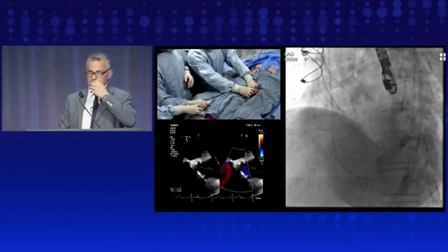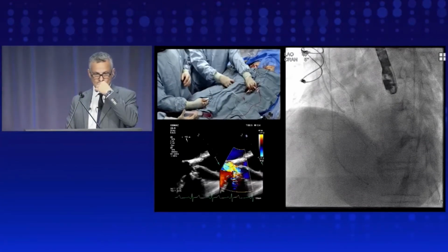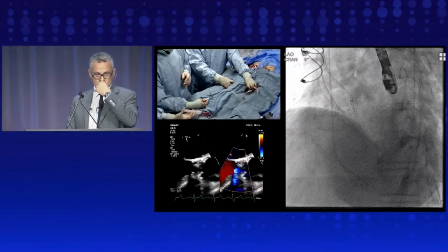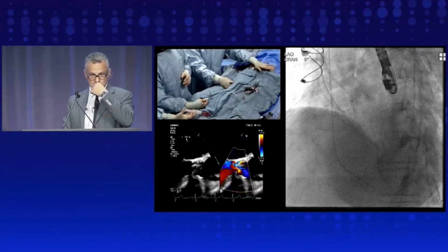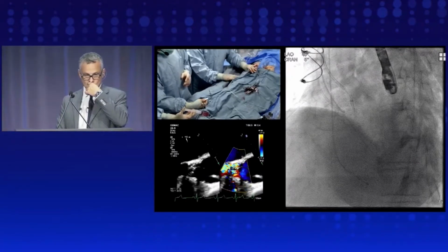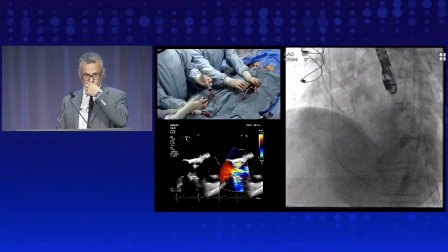Okay, so just before you pull, to Francesco's point, and we're obviously on cue for this, once we do this laceration, we're going to try to move rapidly to get the CoreValve in place. And Dr. Aldea and Danny will get that position ready to go. Yes, absolutely. We will need to have a pigtail going through one of these sheaths in order to perform the TAVR. And this pigtail will have a Confida wire. And after that, the Evolut Pro will go over it sheathless.